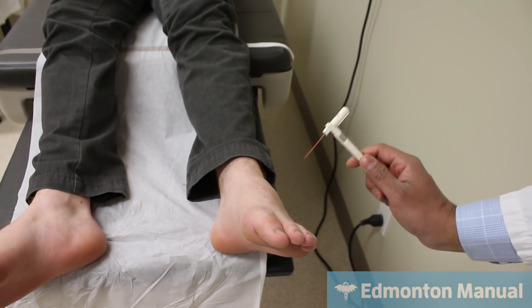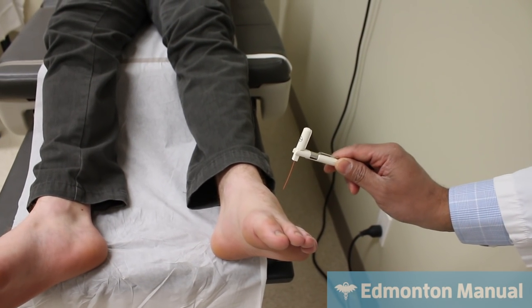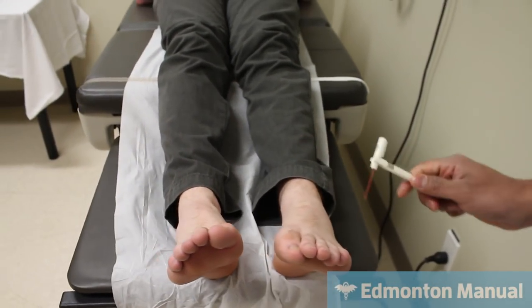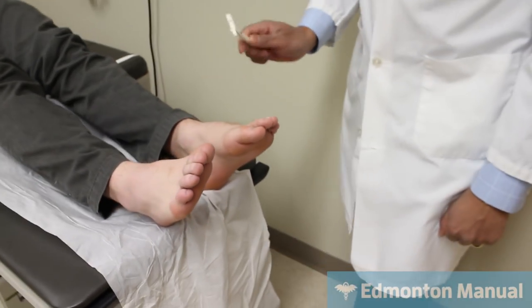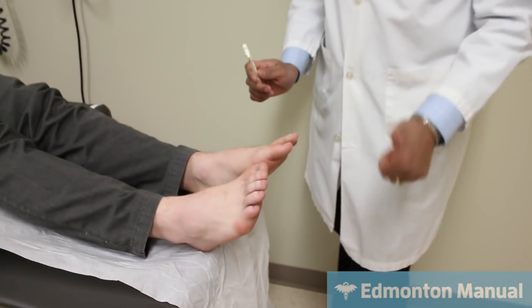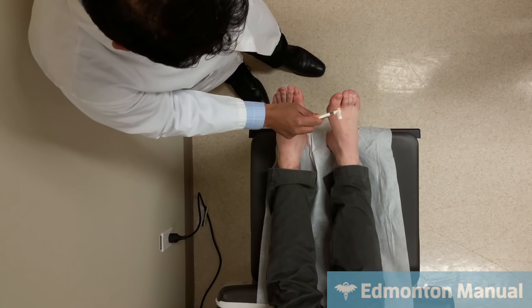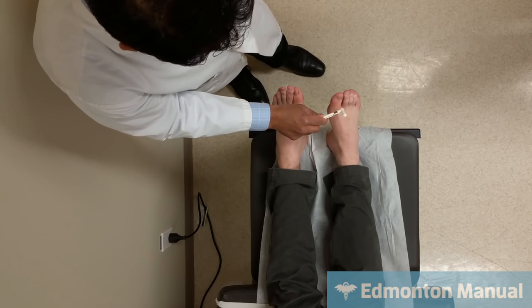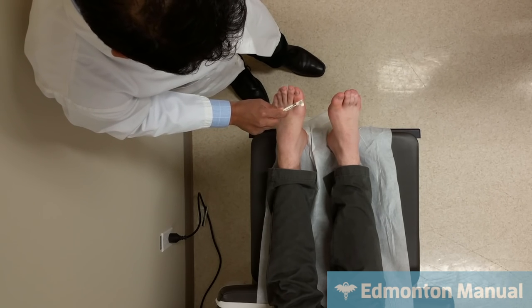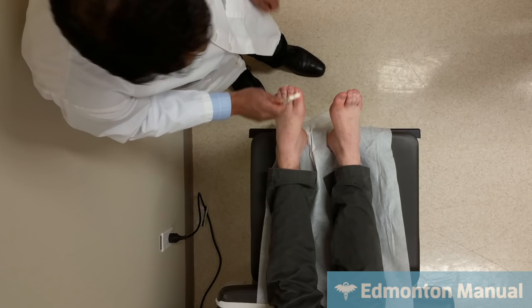Can you feel that? Yes. Okay, and does it feel the same as above? Yes. Okay. So what you then can do, I'm actually going to do both feet. If you could just put your feet together a little bit more, okay? And I'm going to go back and forth, changing the rhythm, and you tell me when you feel it, if it feels normal or reduced, okay? And all of them felt normal?